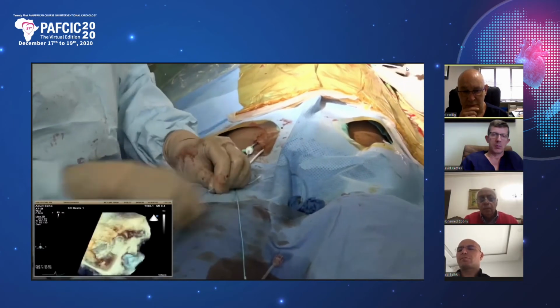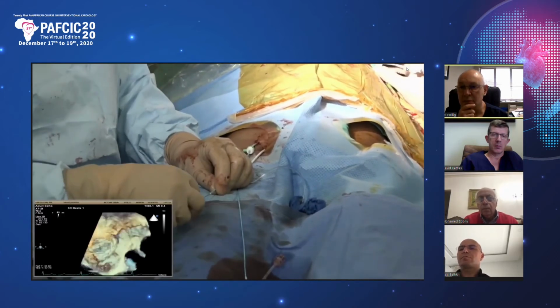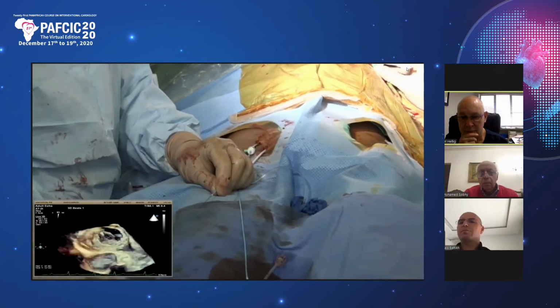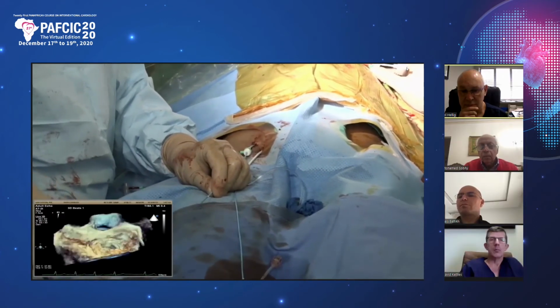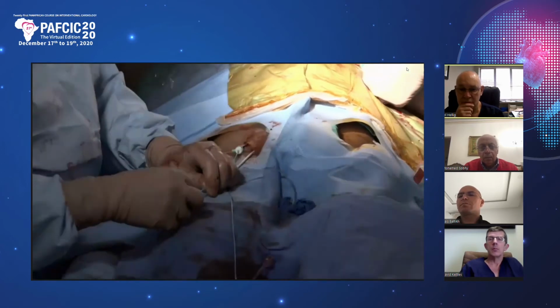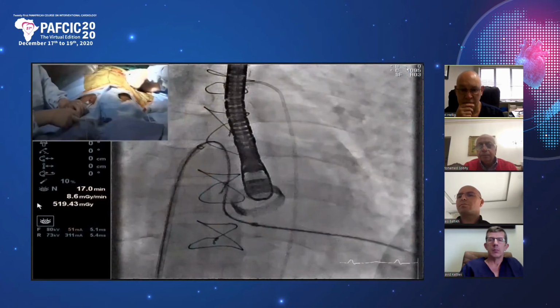And this would start, it's just easier to push out the catheter this way. And then I'm going to be working from this end, so I don't want to keep working on the floppy end. So I'll ask Shaheen to just hold the catheter tight. Screen. So you see things are starting to straighten now.